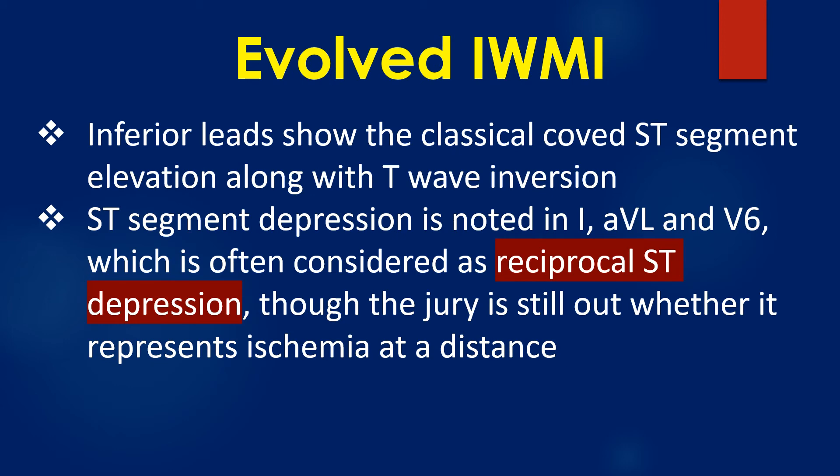Inferior leads show the classical coved ST segment elevation along with T wave inversion. ST segment depression is noted in leads I, AVL, and V6, which is often considered as reciprocal ST depression, though the jury is still out whether it represents ischemia at a distance.